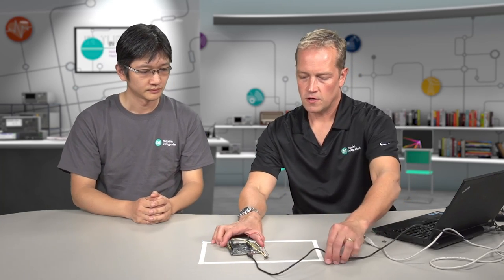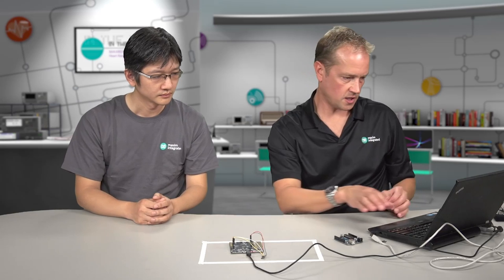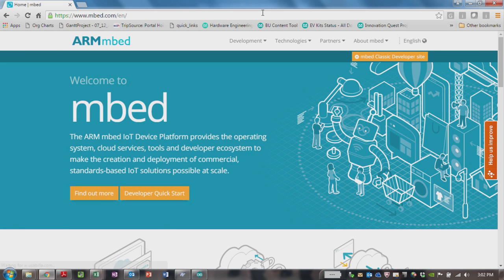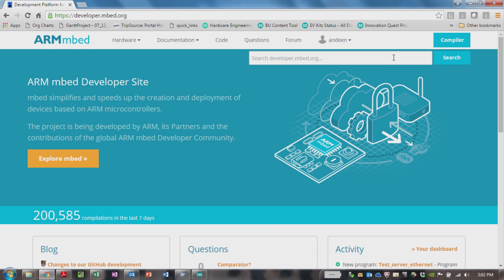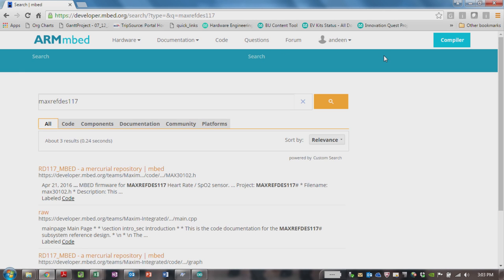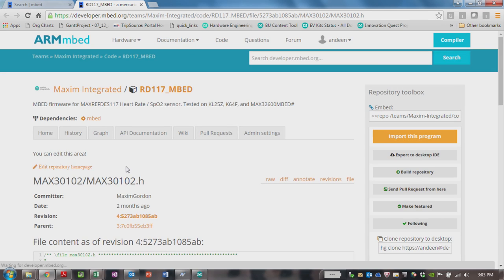So we are all wired up here, and I'm just going to go ahead and go to mbed. It's online here, so let me go to the website, mbed.org. And when you get here, you always have to click on this classic developer site button to get to the types of things that we are developing. So when you get here, you can just search for MAXREFDES117. And it'll take you to the right place for this firmware. Okay, so it says RD117 mbed. Is that the right stuff? Yes.